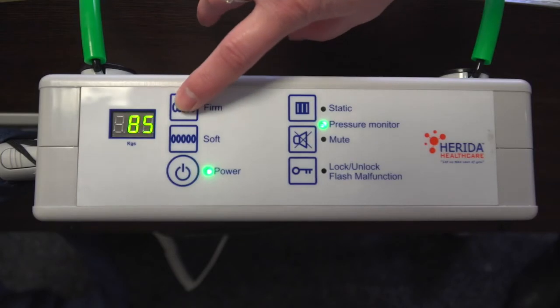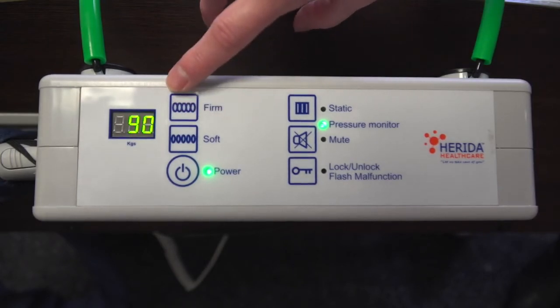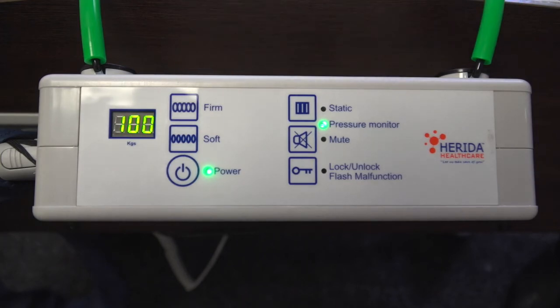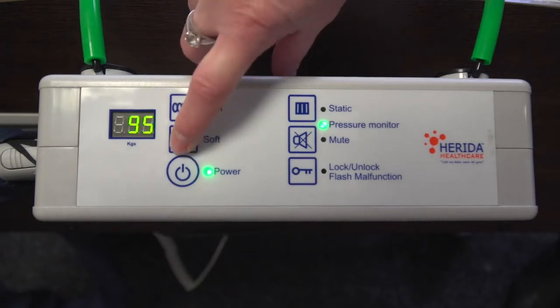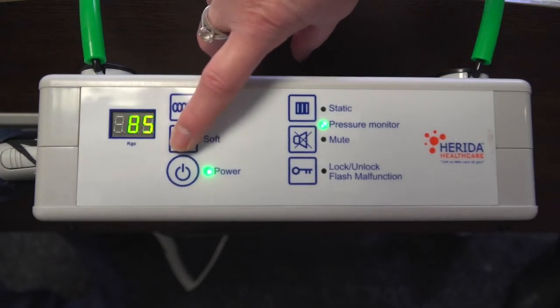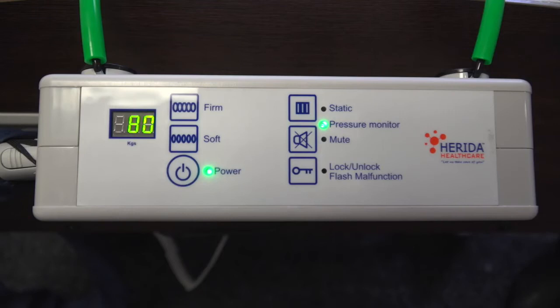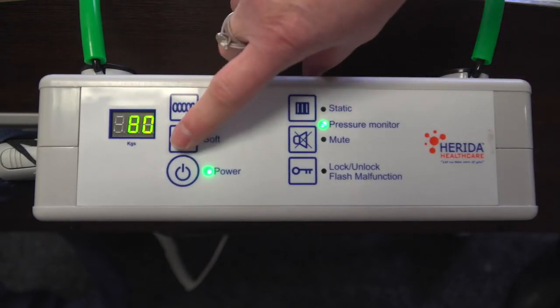To increase the patient's weight and pressure, use the firm button. Pressing this button once will increase the pressure in increments of 5kg. To reduce the pressure or weight setting, press the soft button — this will also adjust in increments of 5kg. The pump is designed to offer ultra-low pressure delivery for lightweight, frail individuals, including paediatric patients. If the pressure is too firm or insufficient for the patient, the clinician can at any time override the system by using the soft and firm buttons accordingly.